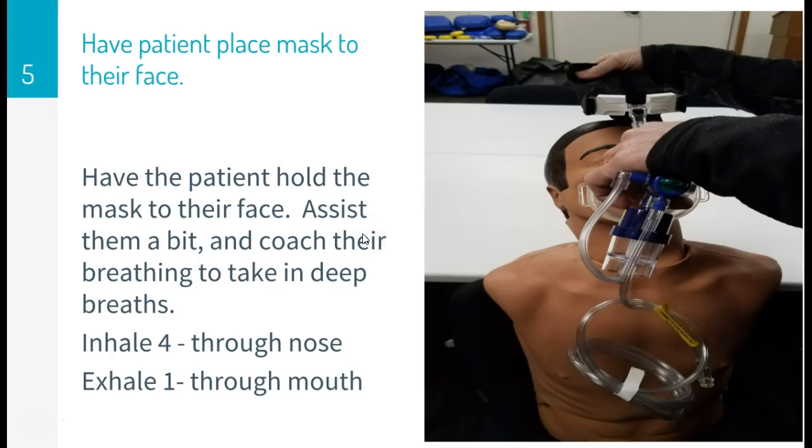First thing, obviously, is to get the mask on that person's face, and obviously it's kind of scary. This thing is howling. It has a lot of air pressure on somebody's face. A lot of people don't like it, and so usually best is to have them kind of hold the mask up to their face so that they can get used to it. Try to coach them a bit.